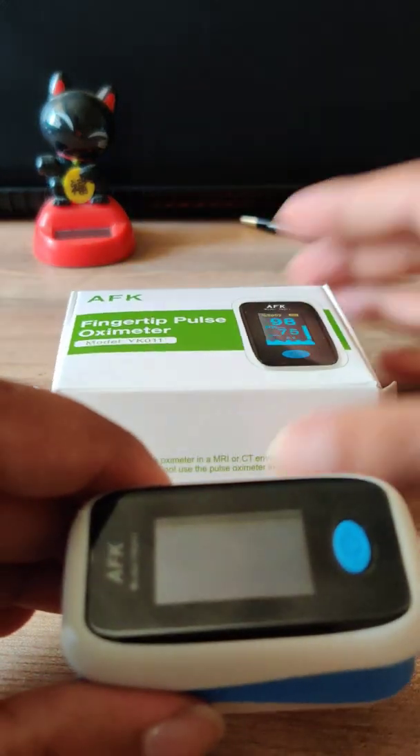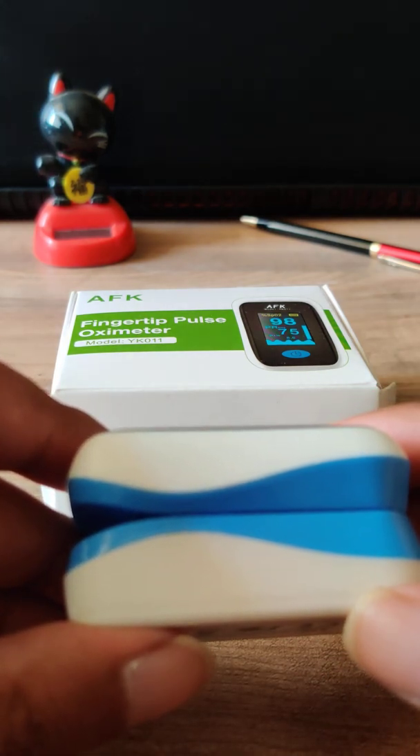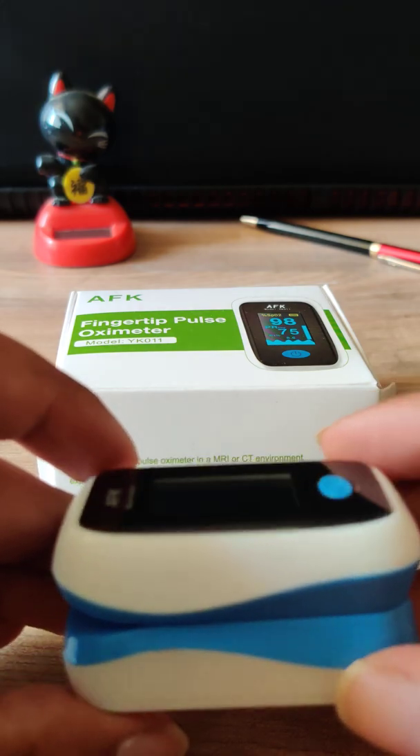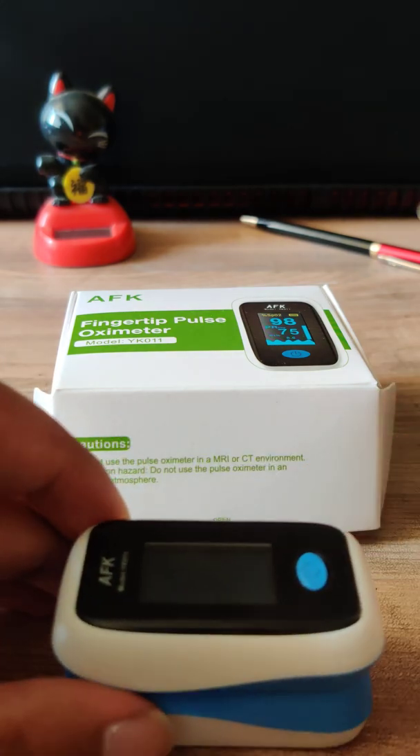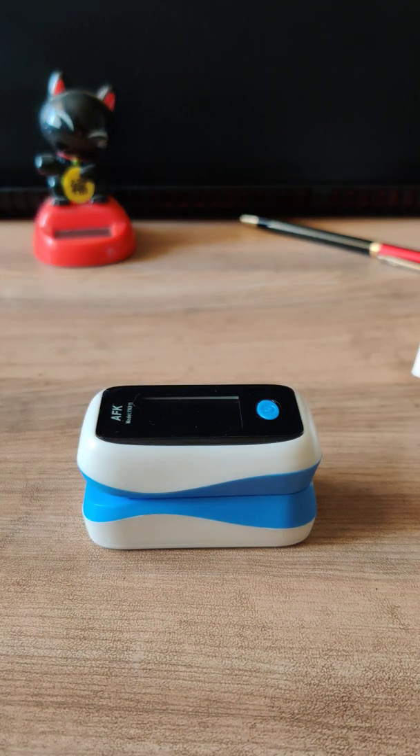You'll be using the oximeter around four times a day — continuously keep track of your SpO2 levels in your body. Once done, keep track on a daily basis so you can report to your doctor and make sure you are staying healthy. This device cost me 1200, but please check e-commerce websites like Flipkart or Amazon and you might find a good deal for around 600 to 700 rupees. This is how you'd use a pulse oximeter to keep yourself safe during COVID times. Thank you.